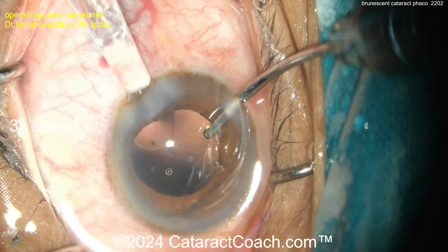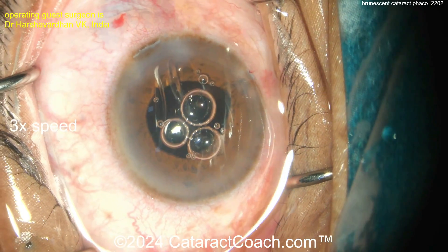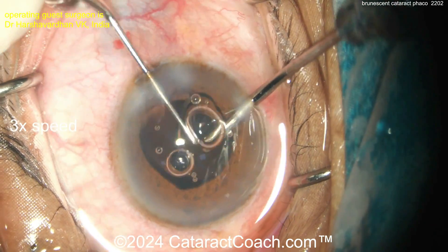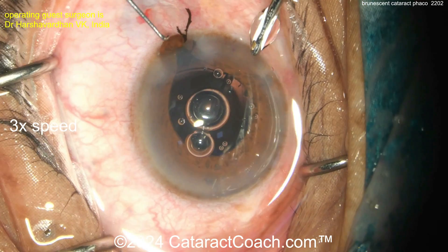Back to the case: cortex removal is pretty easy in these dense cases. An infusion cannula going in left-hand, then the right hand injecting the IOL — getting that IOL in the bag. With a smaller pupil, make sure both haptics are fully in the bag, not leaving a haptic in the sulcus. Iris prolapse — put that back in right now.